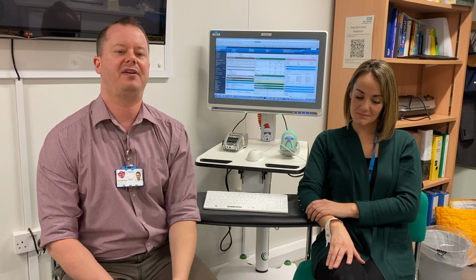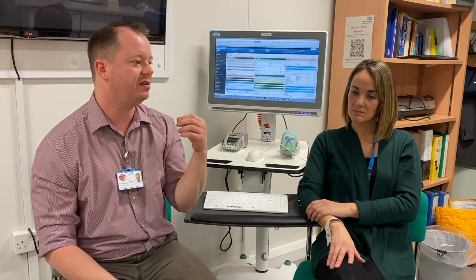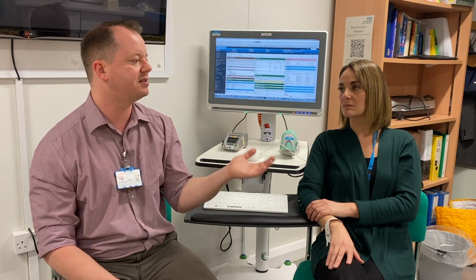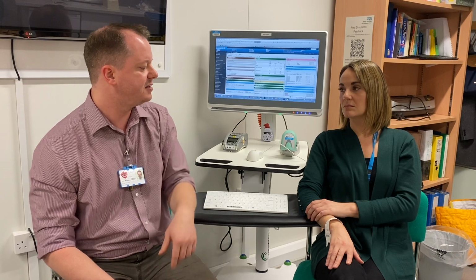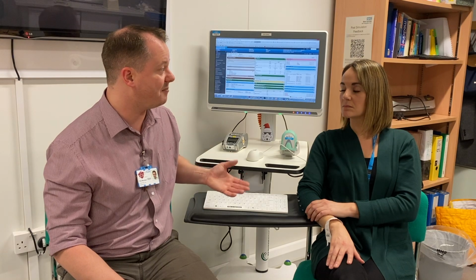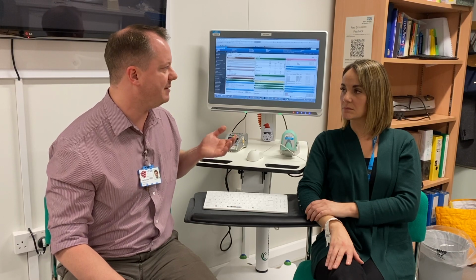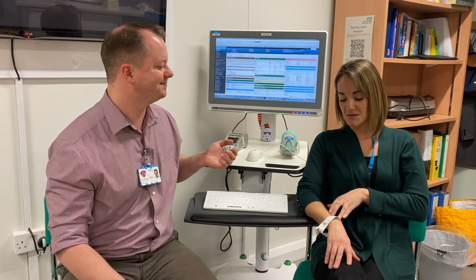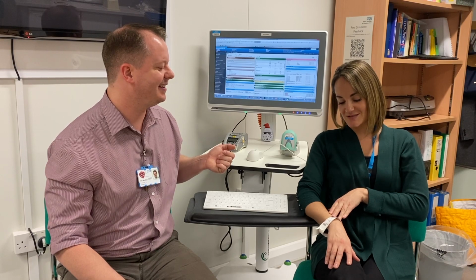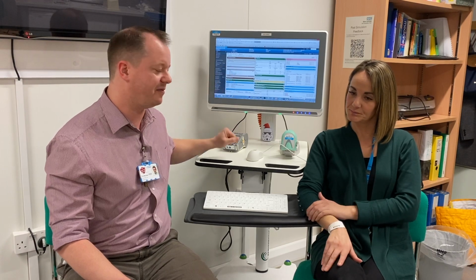If you are going to identify someone, first of all we ask you to verbally identify them. We want to make sure we do that by not giving them their name or date of birth for them to say yes or no. We want to ask them to tell us their name and date of birth. So I would say to the patient, hello, my name's Tom, I'm a nurse, I'm here to take a blood sample, is that okay? Yep, no problem. So before we get started, can you please just tell me your name and date of birth? Yes. Of course, I'm Sim Z. Damone, and my date of birth is the 1st of January 1968. Brilliant. And I could check that against the record that I've got here.